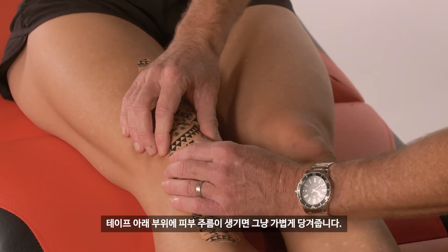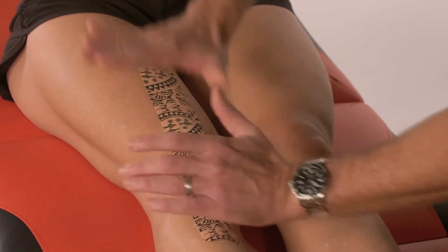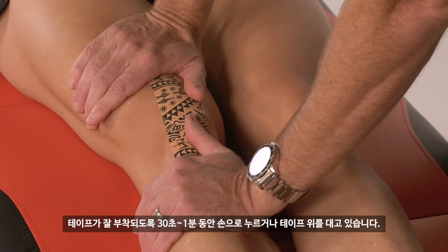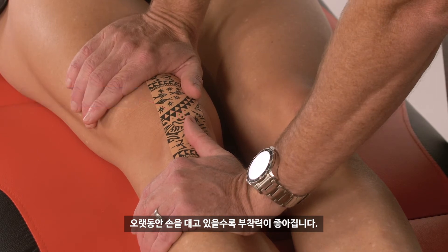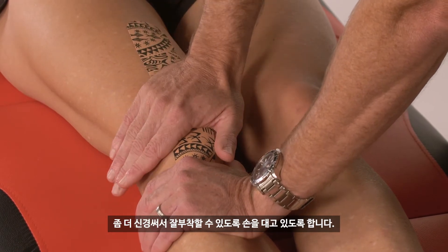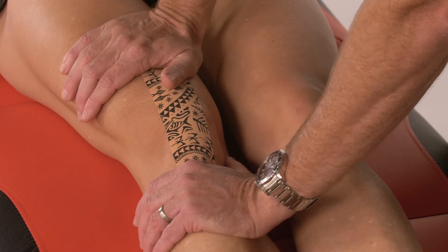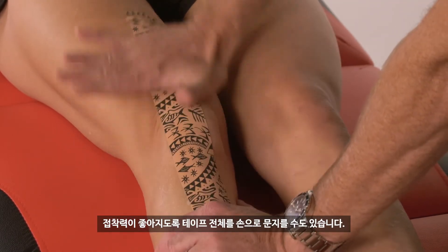If you have any creases under the tape, just simply pull those out. For maximal adhesion, you want to press and hold for 30 seconds to a minute — the longer we hold, the better it sticks. Particularly if we are crossing or overlapping the tape, you want to hold very well where that tape crosses. You can then give the whole thing a rub just to maximize that adhesion.